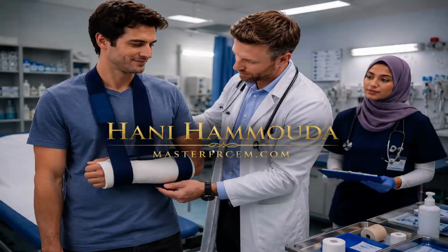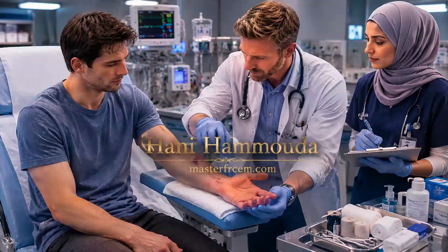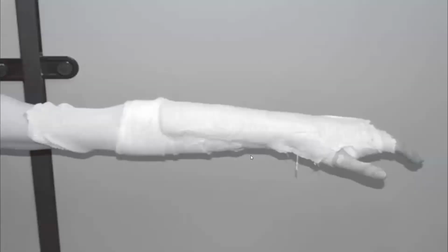Excellent, Omnia. Perfect. 10 out of 10. So the station is very short, but in the exam, you will apply it, so it will take time. Clear? Okay. You still have 2 minutes, and in the exam, a further 2 minutes, so 4 minutes, more than enough to apply while you are verbalizing also. Clear? Clear. Well done. So when you are applying the stockinette, for example, you are talking. You will measure from here to here and then cut, then apply. Then cotton pad, apply. When you are talking, apply. So it will save time and so on.